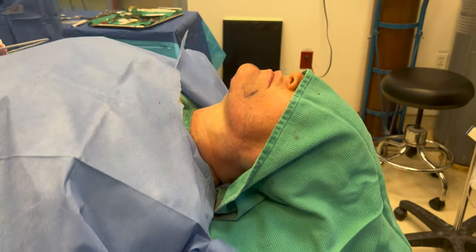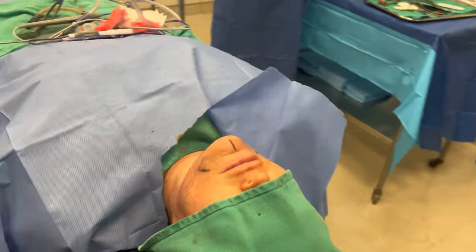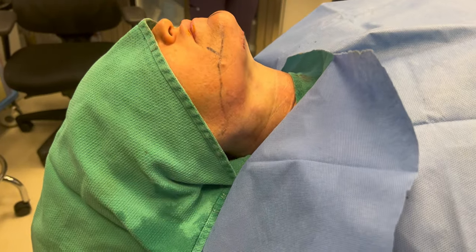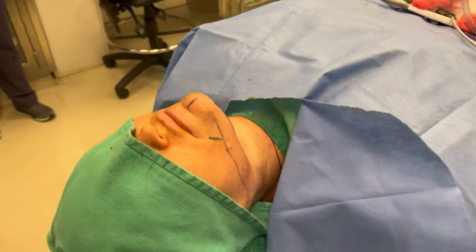And we are done with the deep neck lift — reshaping and reducing the submandibular glands, tightening the muscle, removing a little bit of fat, a little bit of neck liposuction, and tightening the platysma muscle. Thank you.